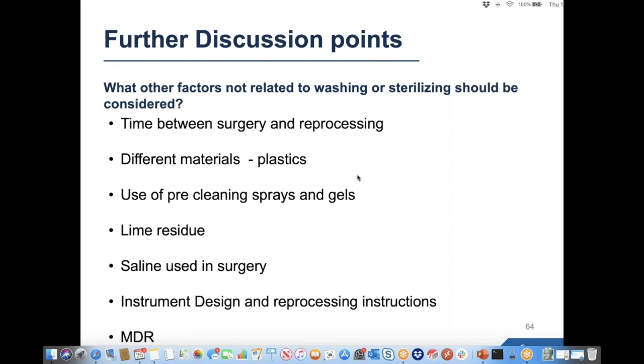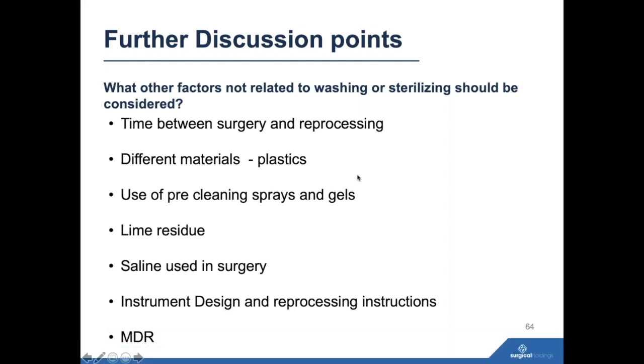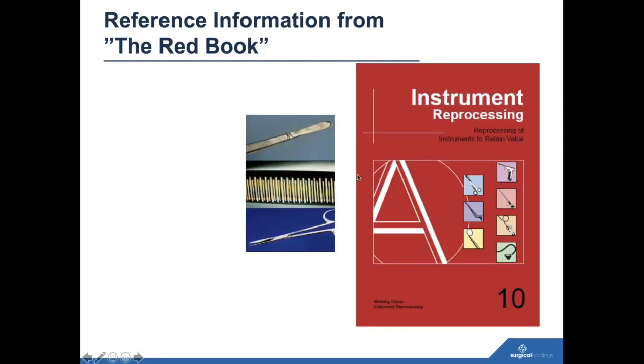Okay. Well, it's certainly something worth exploring, and I think we're more or less coming to the end now. I just wanted to reference the famous AKI working group Red Book. This is a document produced by a collaboration of companies in Tuttlingen. There's really great detail around water spotting, discoloration and corrosion. You can literally read through the ins and outs.